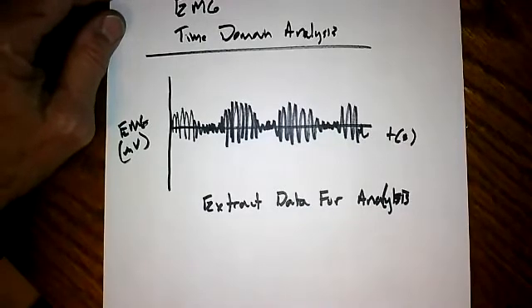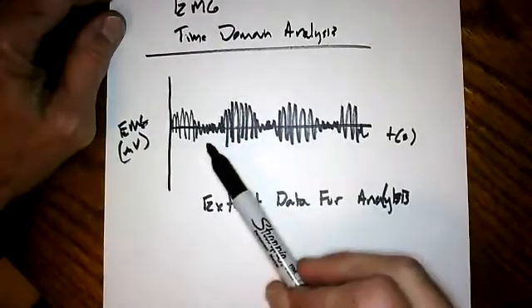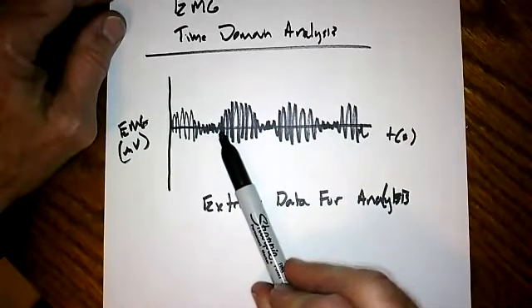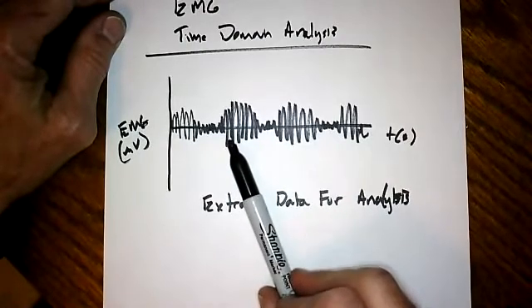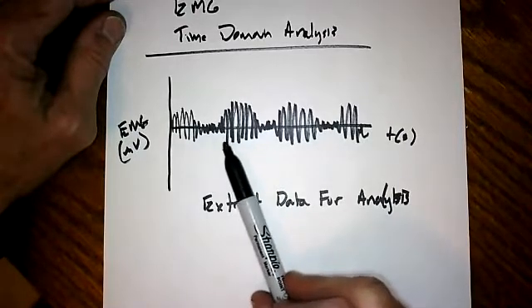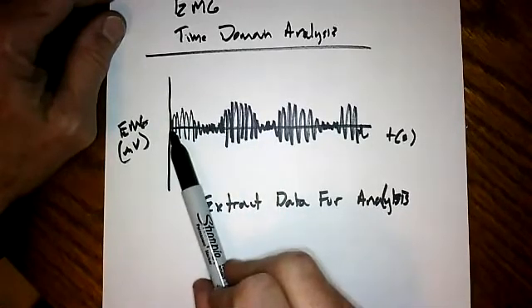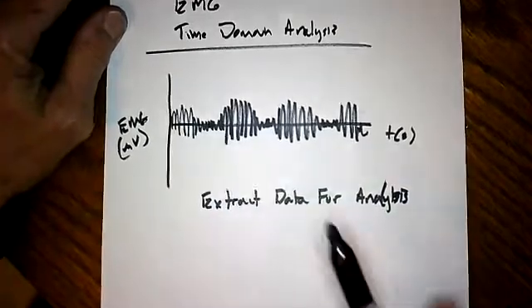But I'm going to start with the idea that you need some kinematic marker to be able to say, I'm going to start my analysis at this moment in time, or maybe this moment, or maybe even this moment. You need a reason and an objective measure to say when data analysis starts. This time right here is where I just pushed the button to collect data. That time zero is just arbitrary. It has no meaning. So you need something that goes along with this.